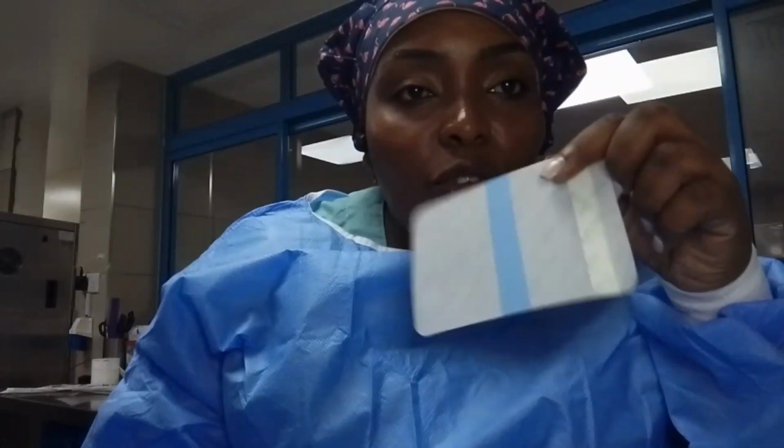Now, the other thing that you need, I'm trying to gather to show you. This is a dressing, this is another drape. These are dressings. You need dressings. Then you need sutures, because after you've placed your central line, you have to hold it in position using sutures.